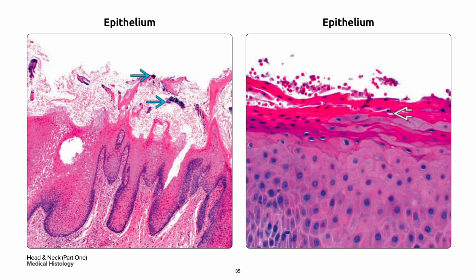On your right are areas with increased friction, like the epithelium near the lips, that may show areas of parakeratinization. They are characterized by flat eosinophilic cells with retained pyknotic nuclei in bold white arrow.